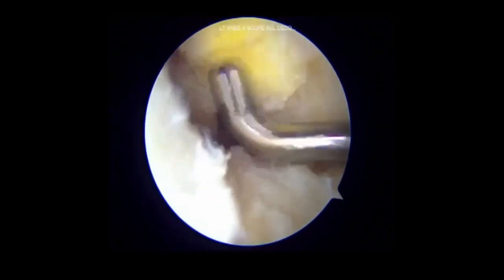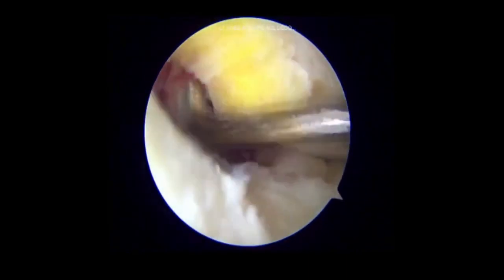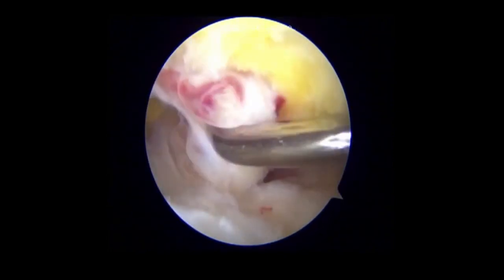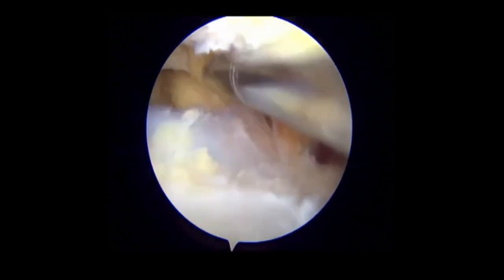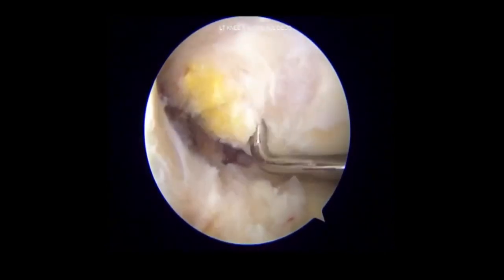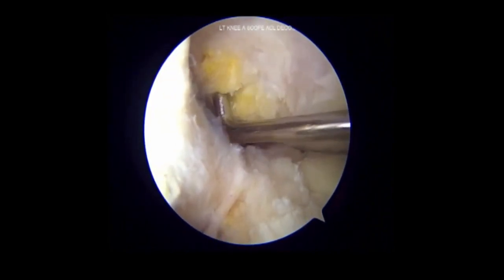The probe is then passed to palpate the posterolateral compartment for any residual mucoid tissue, which is then shaved off, confirming adequate decompression of the posterolateral compartment. The probe confirms an adequate clearance. The femoral footprint of both the bundles is probed with the hook probe.